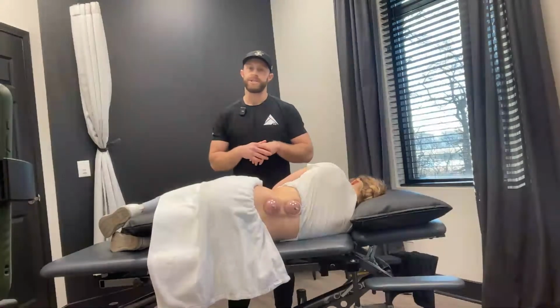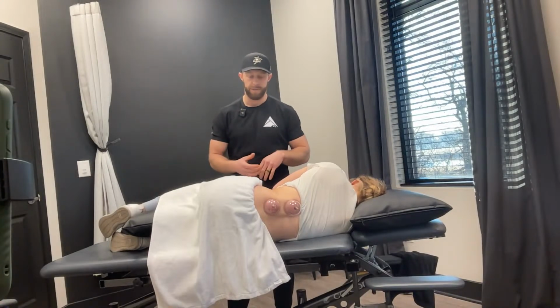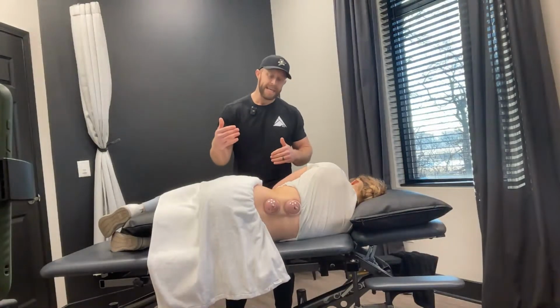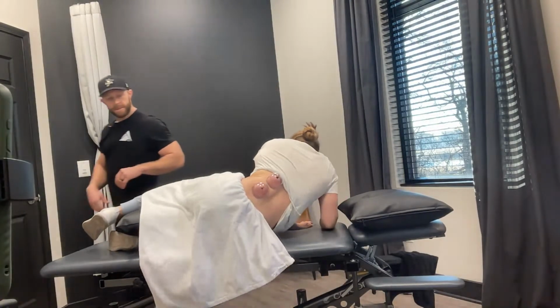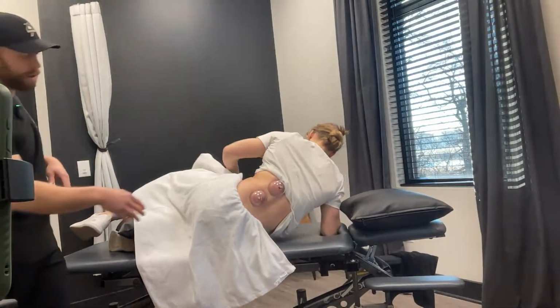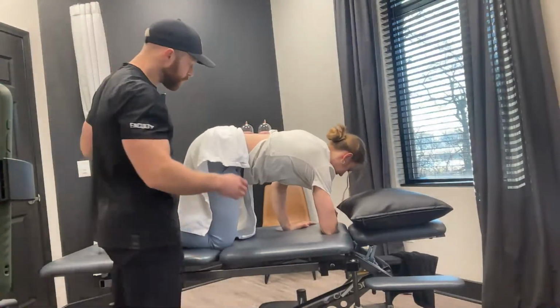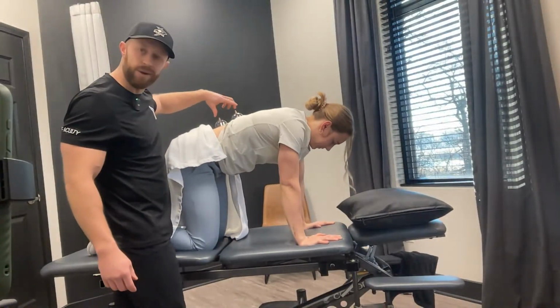If I do perceive that the person, if they're telling me, hey, this feels quite a bit better, it seems like they would like a little bit more treatment, the next move I'm going to have them carefully make is getting into the position of quadruped. So they don't like prone and supine, so I'm going to leave the cups on, and the person's going to ease their way to quadruped. And then from this position, they're just going to do some gentle angry cats.